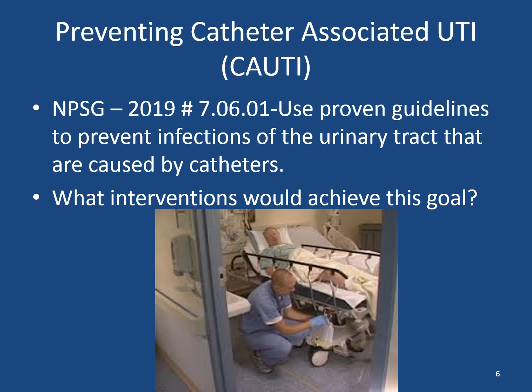And we would want to replace the catheter as needed. If the catheter has been in too long and it's a higher risk for infection, we would want to replace it routinely, just not excessively frequently if we can help it. The increased times that we remove a catheter and put it back in, we're increasing that risk for infection.